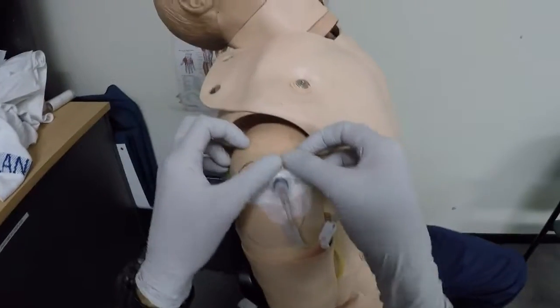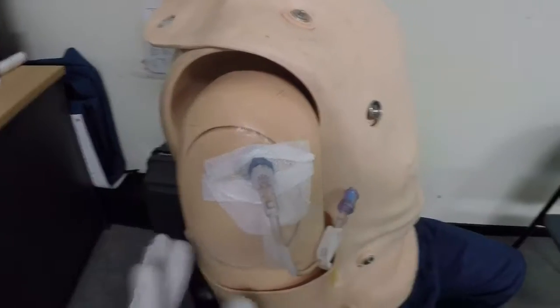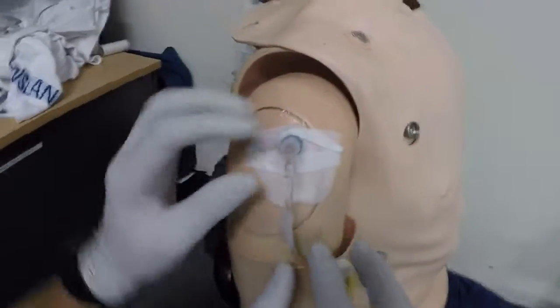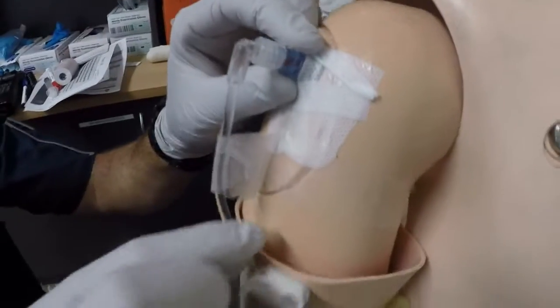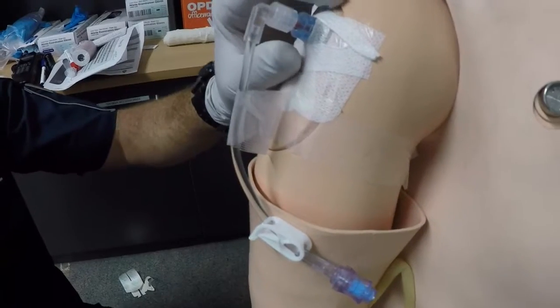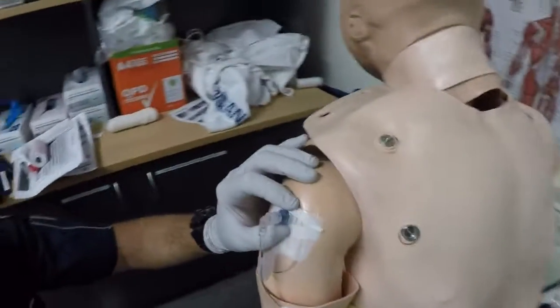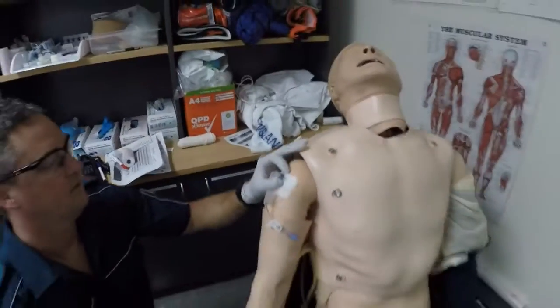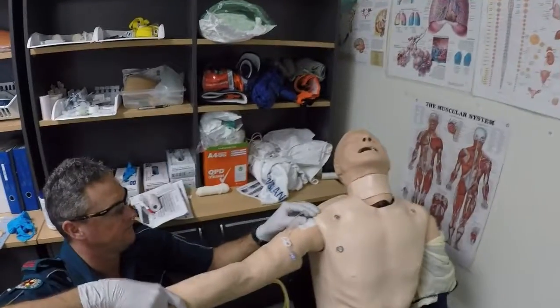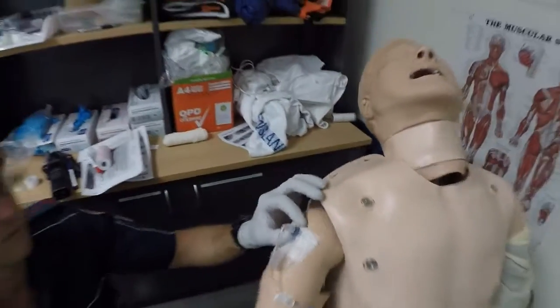So this is an example of an appropriately secured proximal humerus IO site, opsite over the IO needle to ensure sterility and stop foreign particle ingress around the insertion site, and then with the actual giving line also appropriately secured so that it can't be pulled out if the patient's moved or if it gets caught on anything. Just to reinforce what we were talking about earlier, particularly with a humeral insertion, we want to immobilise the arm to prevent superior rotation of the arm against the acromion process, which can cause either damage or snapping off of the IO needle.